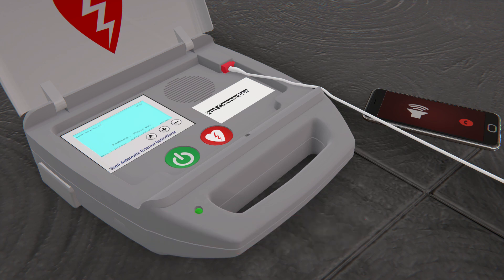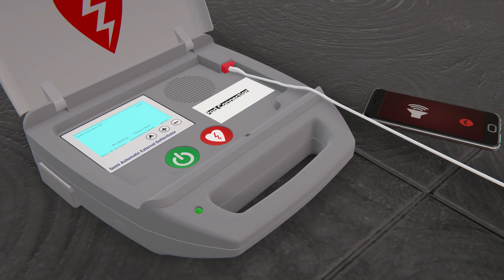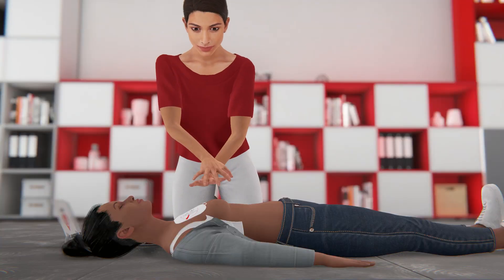Follow the prompts and let the AED analyze. The AED will say: "Analyzing heart rhythm — do not touch the patient." Make sure that no one is touching the person. The AED will analyze the heart rhythm. If the AED tells you that a shock is not needed, resume hands-only CPR.